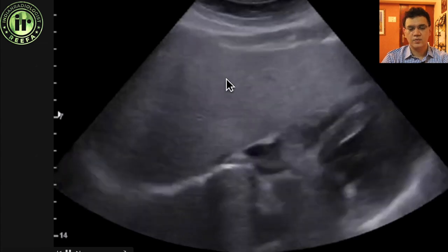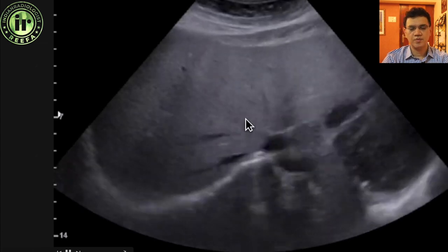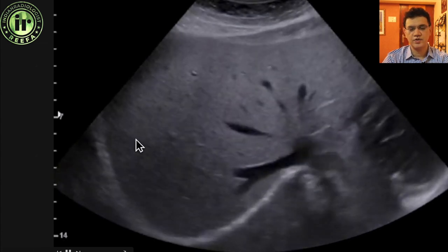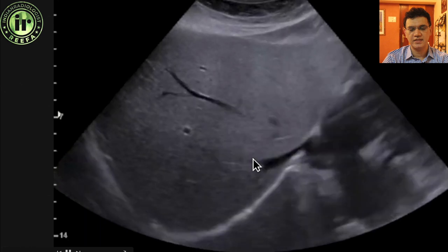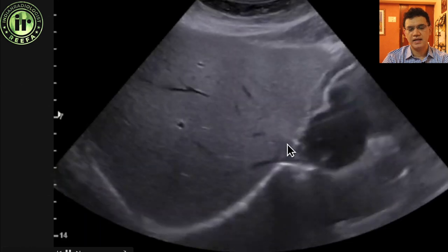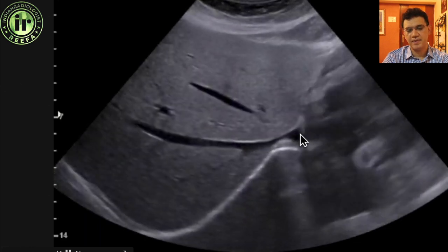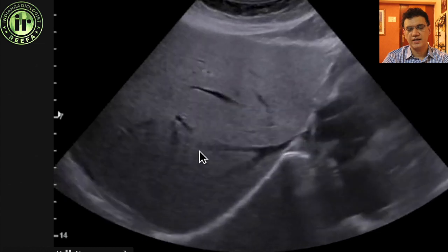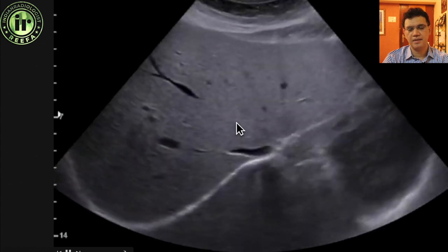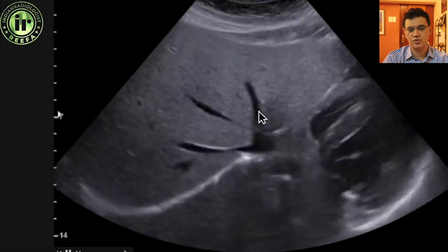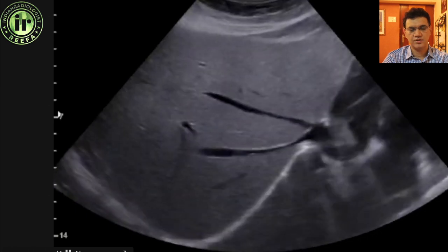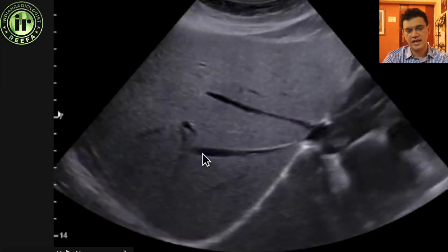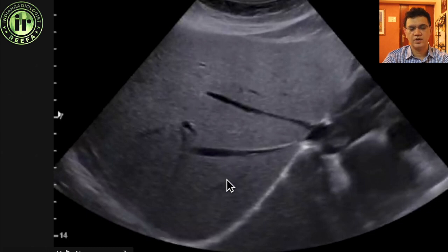Let's start scanning. At the top of the liver you can see the IVC. This is the right lobe, and we can see the right, middle, and left hepatic veins. So you can see the right hepatic vein here, middle hepatic vein here, and left hepatic vein here. The segments lie between these veins.